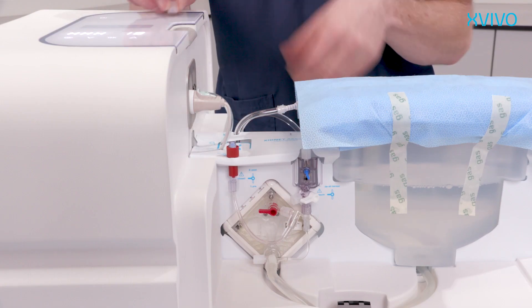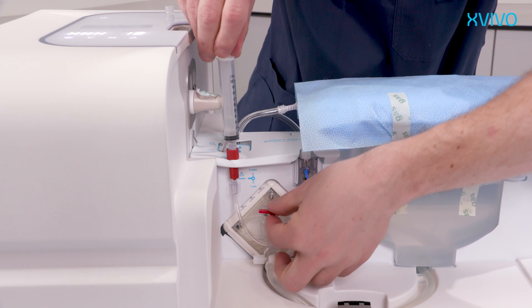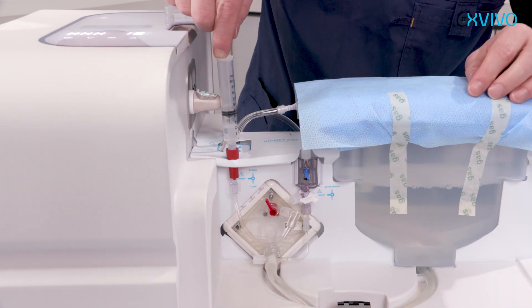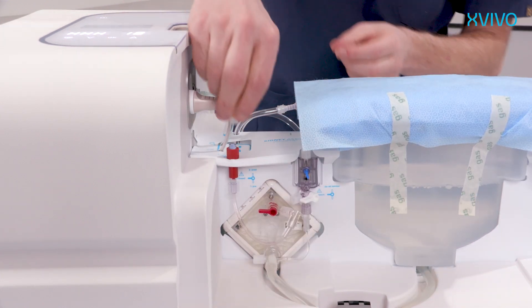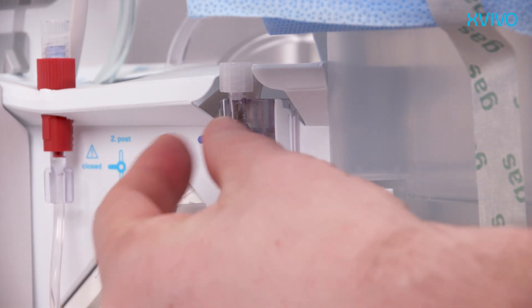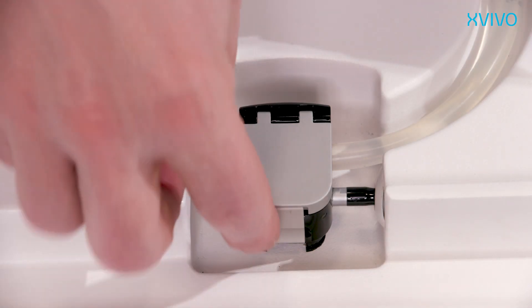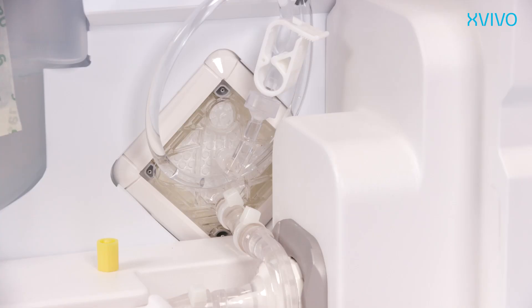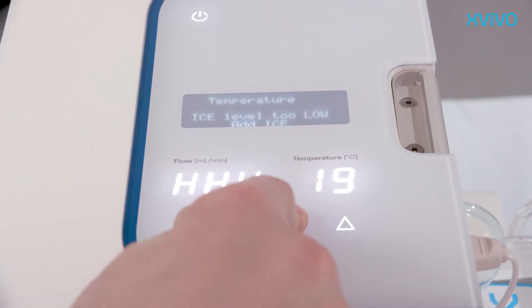De-air the oxygenator via the red sampling valve by using a syringe. Aspirate with the valve in position 1 until no more bubbles come out. After de-airing, replace the red valve in horizontal position and replace the cap. Check if the pressure valve is in horizontal position. Pull the blue tab until a few drops of perfusate come out. Open the flow sensor to check the tubing for air bubbles; if necessary, squeeze the tube to remove them. Replace the yellow cap after de-airing. Press OK to proceed to the next step.